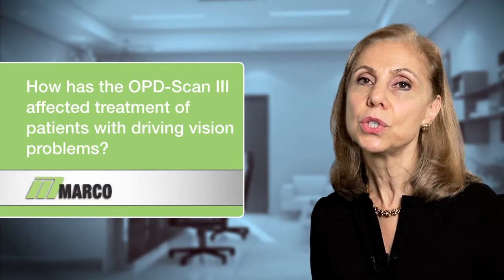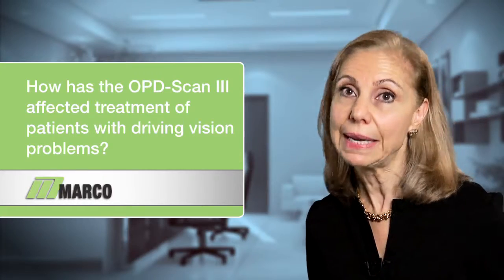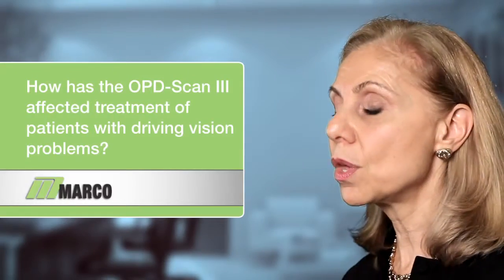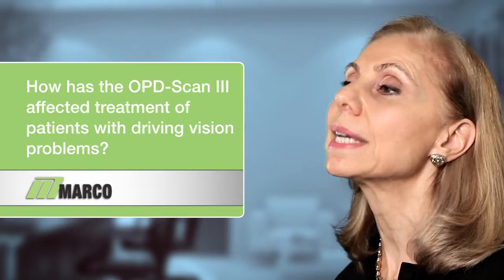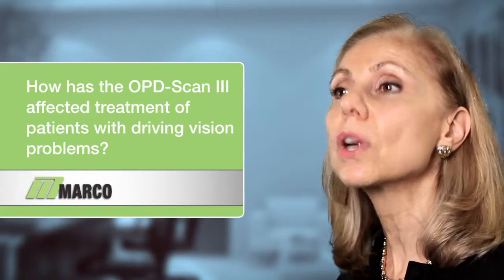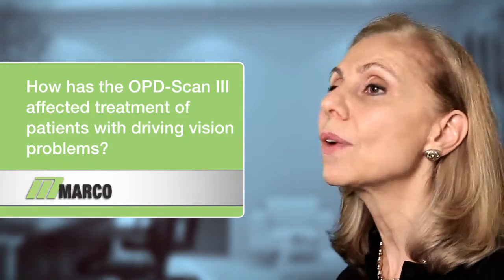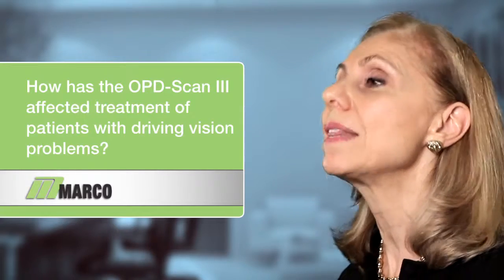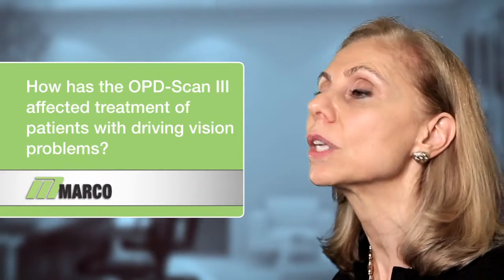What we are able to do now is refract them under mesopic and scotopic lighting conditions. When the pupil size is different, dilated or constricted, a different refractive error is being picked up in a small group of patients. If the pupil is larger, sometimes we're picking up more astigmatism, more cylinder, requiring a very different prescription than daytime driving when the pupil is constricted and they're picking up less of their cylinder in the refraction.